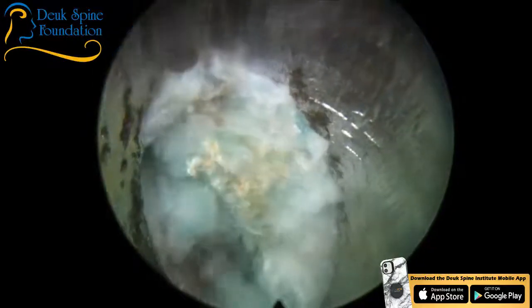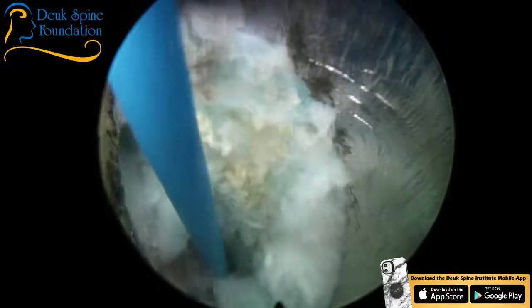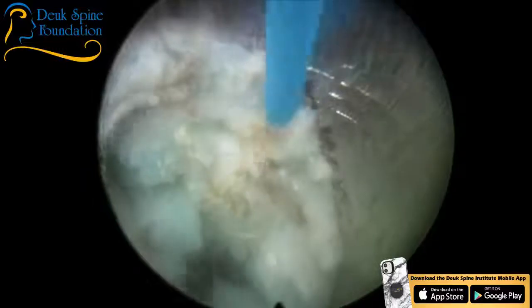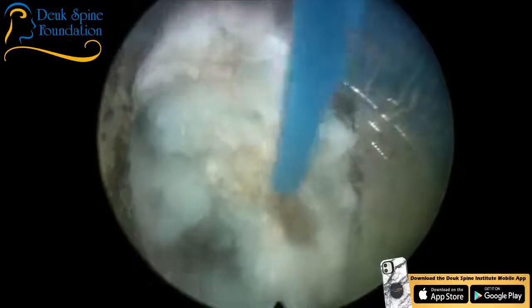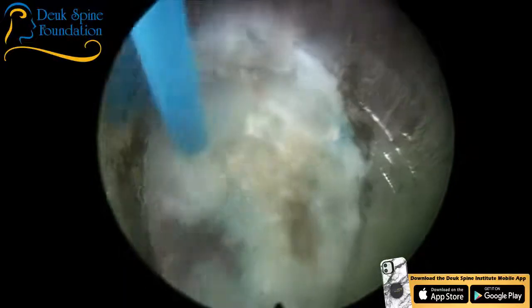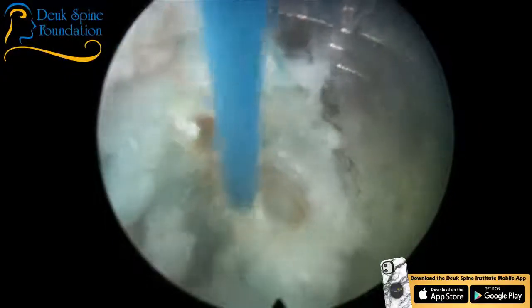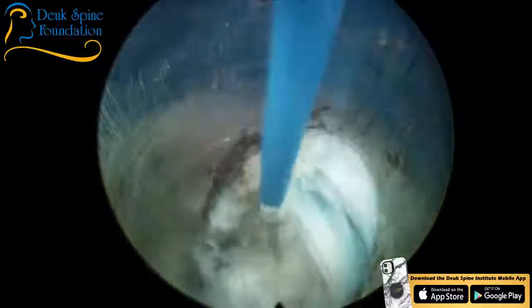The cable, is there any way to give me a little bit more of the fiber, the laser fiber? All that mass there at 12 o'clock you're seeing is the painful part of the herniation. And I'm zapping pieces of it away with the laser, but I'm also going to have to remove some of it with the grabbers. Okay?